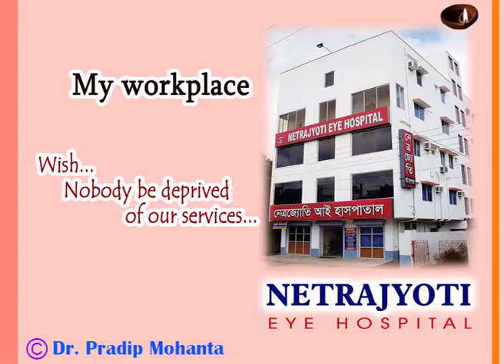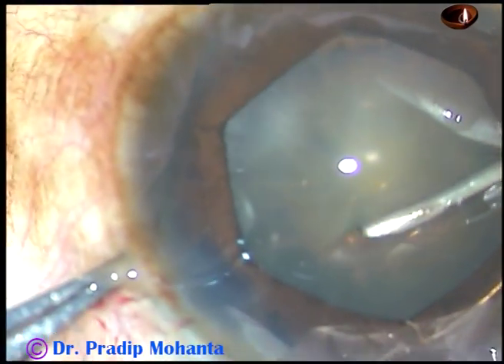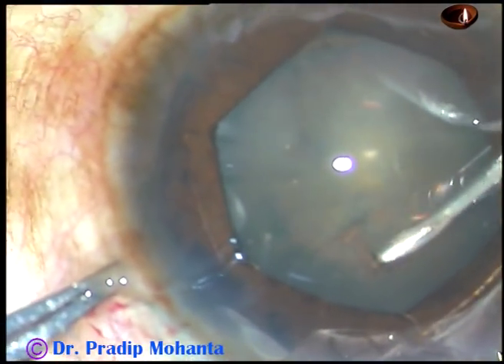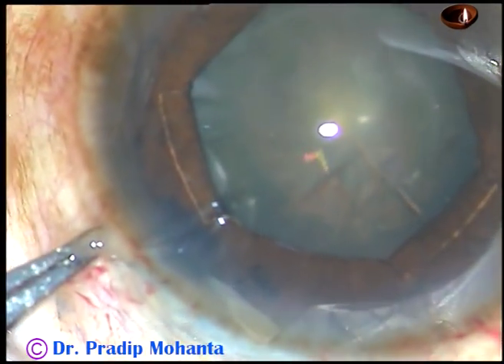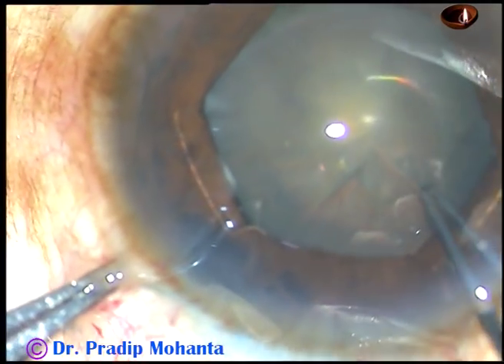Friends, if the pupil is small, cataract is soft, and the uncooperative patient is under topical anesthesia, you may have a tough time as I had in this case. The small pupil was taken care of by applying a B-hex pupil expander.